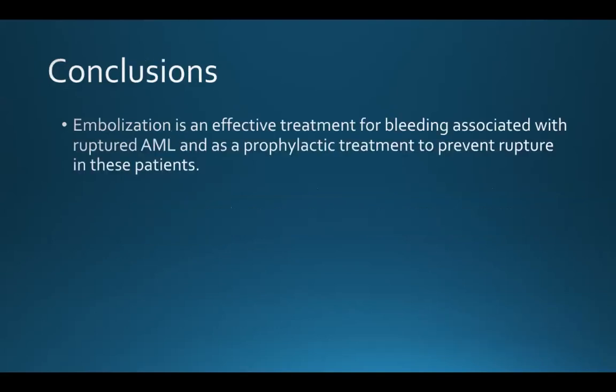In conclusion, embolization is an effective treatment for bleeding associated with ruptured AMLs and as a prophylactic treatment to prevent rupture in this patient population.